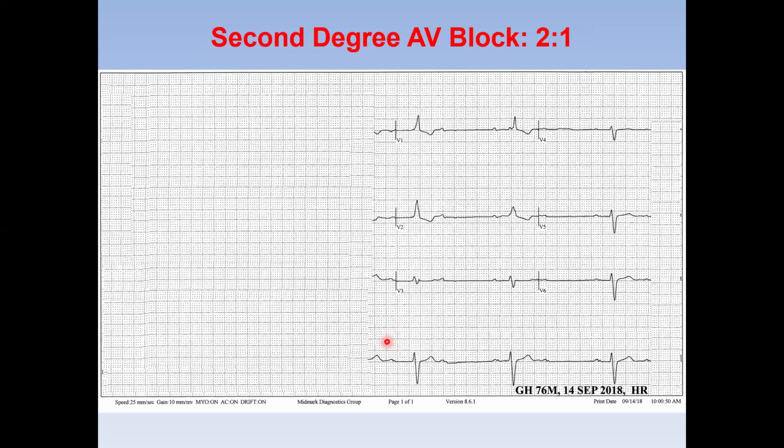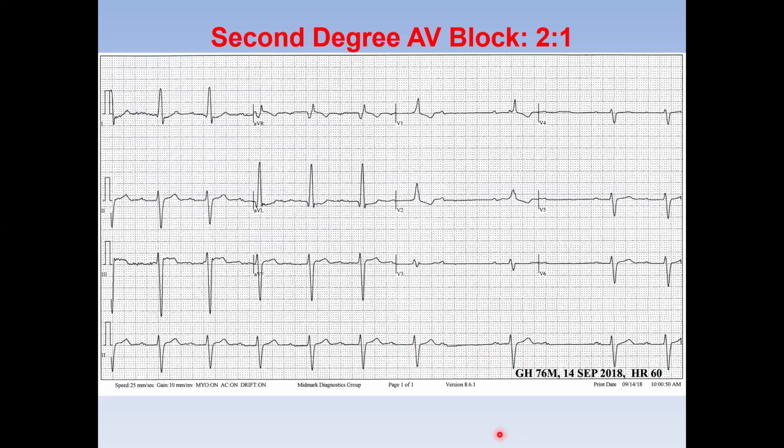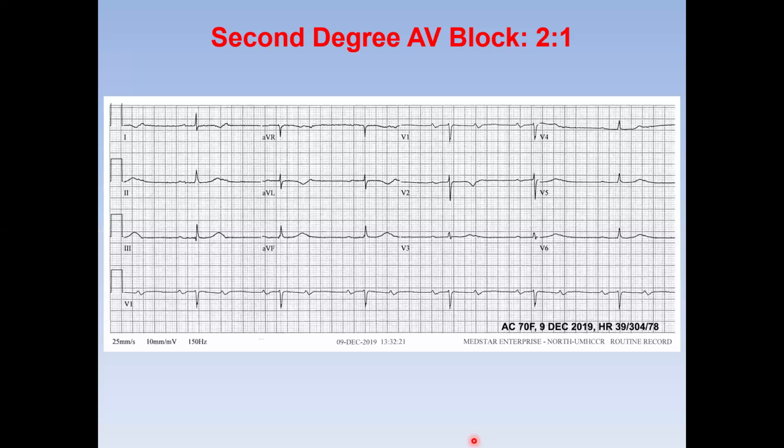So the question is this one. This patient, if you look at this part of the ECG, 2 to 1 AV block, I have nothing else, but look at this patient. It's actually Wenckebach. So where is the block? Sometimes here is a situation, this patient, when it comes, this is 2 to 1 AV block with first degree. You are not committing yourself whether it's Mobitz type 2 or Mobitz type 1.